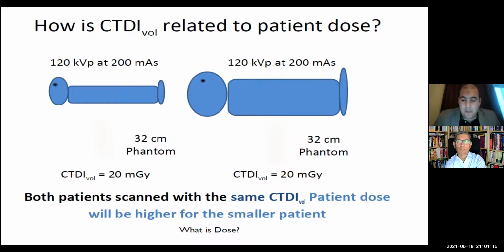Okay, so the AAPM research group, okay, worked together to make Monte Carlo simulations for different phantom sizes, okay, and to get a conversion factor dependent on the patient size, using CTDI volume to give us the average dose of the patient, which is called size specific dose estimate.